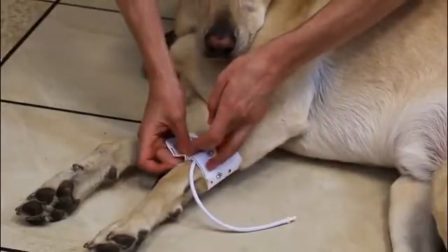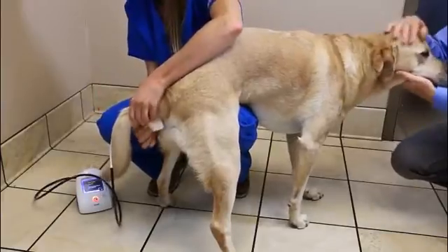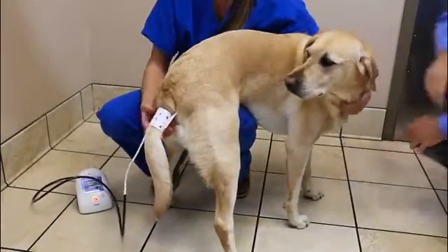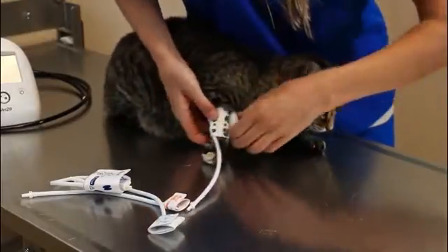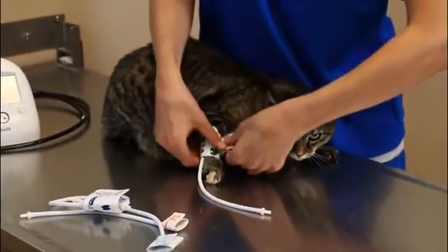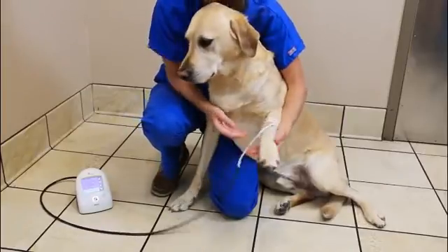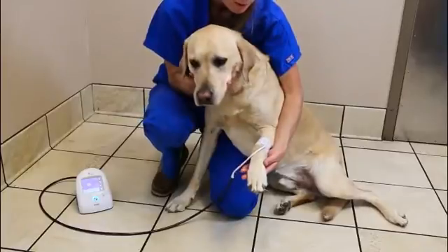It needs to be placed on the correct limb location. For awake cats and dogs, this is usually the front forelimb above the paw or at the base of the tail. The hind limb is often avoided on awake animals due to the animal's lack of compliance in that location — they want to shake it off. Proper cuff placement is vital to achieving accurate BP data. One key goal is having the cuff as close to heart level as possible.